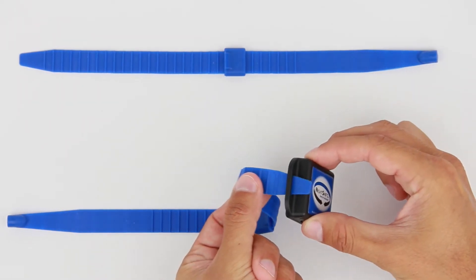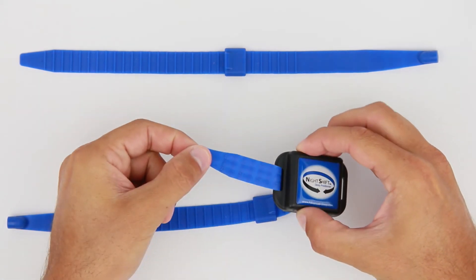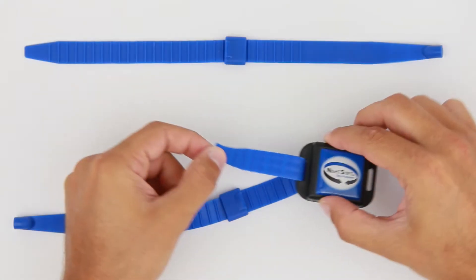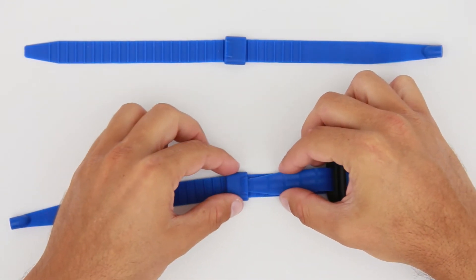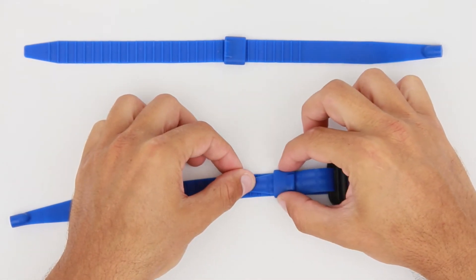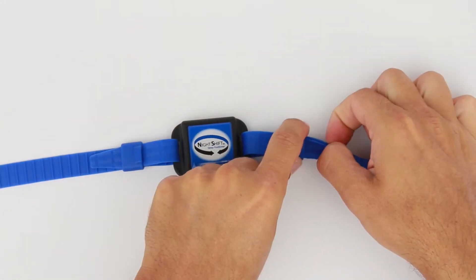Begin by feeding one end of the strap through one of the slots on the side of the device. The strap should be fed through from the back to the front of the device with the ridged side facing out. Loop the strap back and slide it through the retention band. Pull the strap through the band just enough to hold it in place. Repeat this process with the other side.